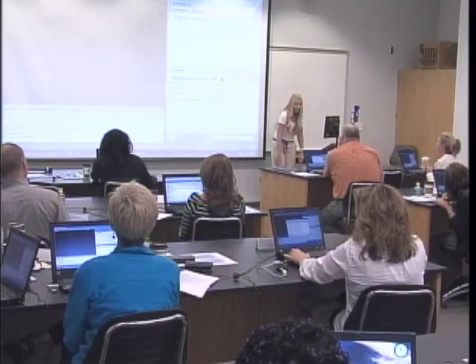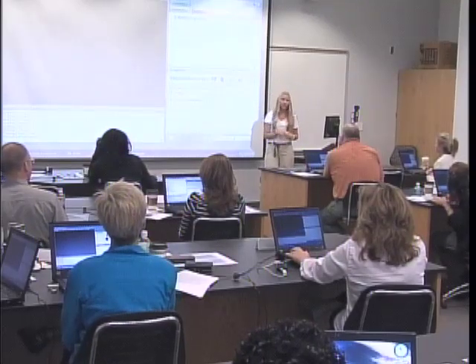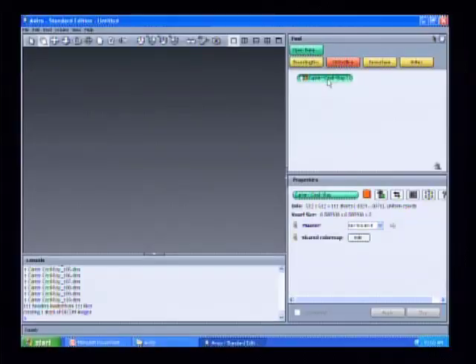So for this particular data set, and this varies for every single scan that you're going to have, these CT scans that were captured were low resolution, and we needed to convert them to a high resolution data sample so that we would have a very accurate 3D bone model. So we've gone through some image processing steps that aren't always necessary.